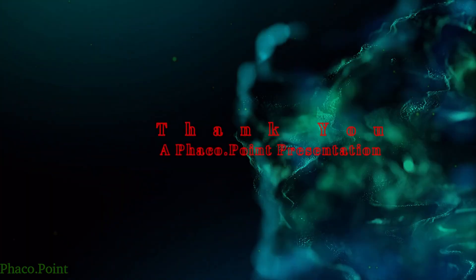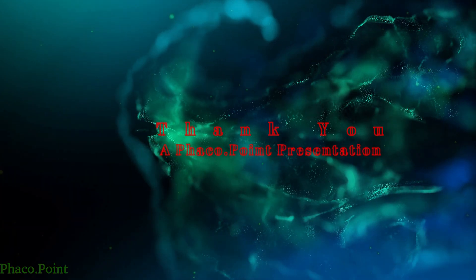A meticulously performed phacoemulsification in a patient with a posterior polar cataract, even when performed under topical anaesthesia, can result in reproducibly optimal outcomes. I hope you enjoyed this video presentation. Thank you.